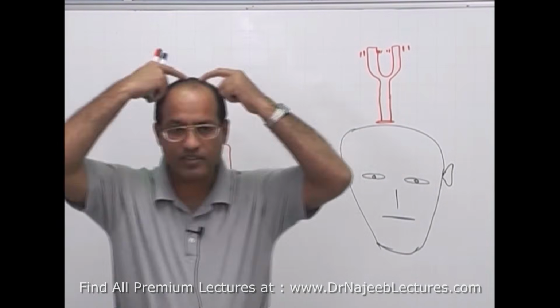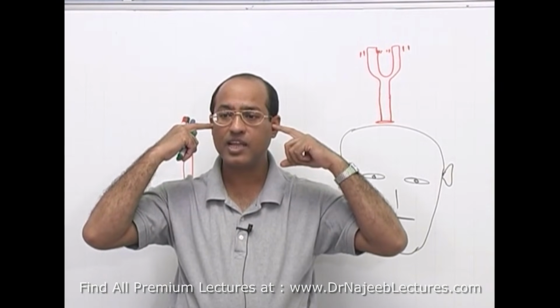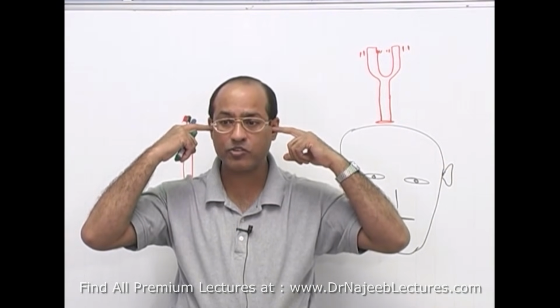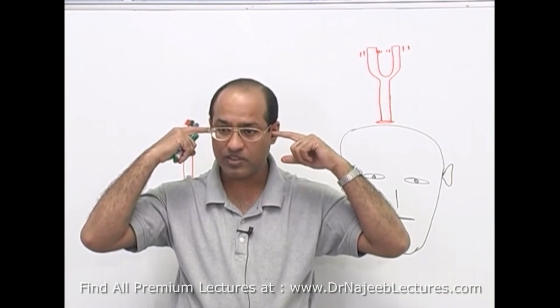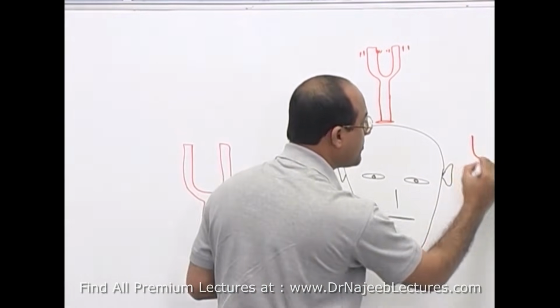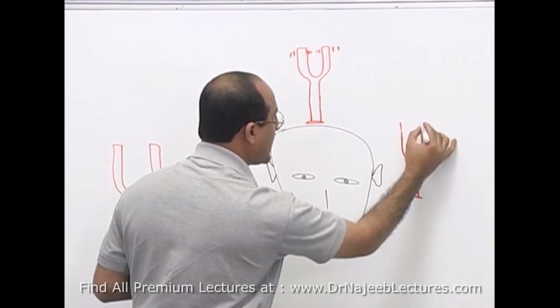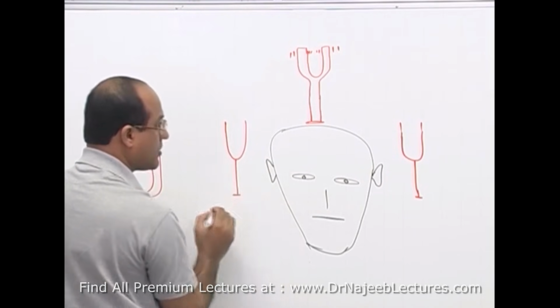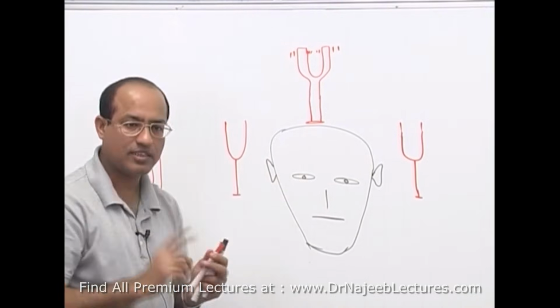bones from both sides. They are passing through the bones and they will come to the ear and directly stimulate sounds through the bone. They will stimulate the apparatus on both sides and action potential will start in both cochlear systems. Is that right? So if your ears are absolutely normal, you will hear as if you are hearing this tuning fork from both ears, and you will hear from both sides equal.